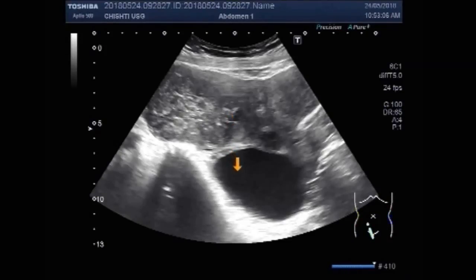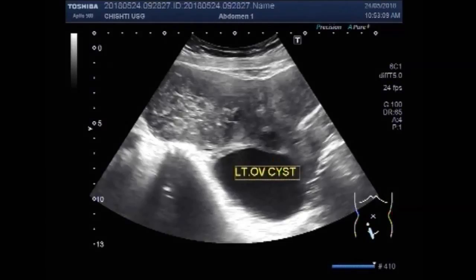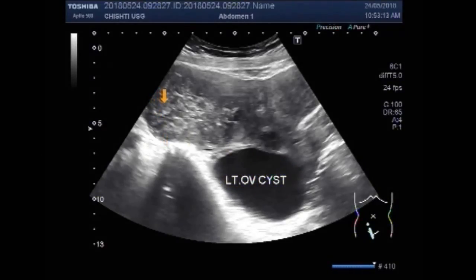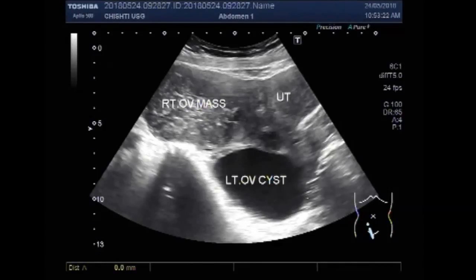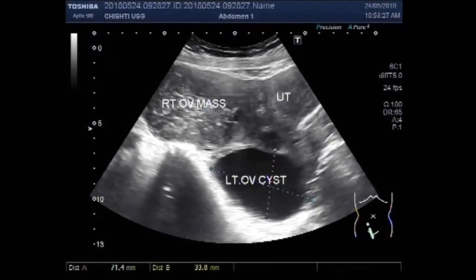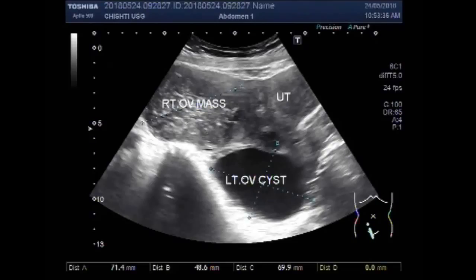Now you can see this is the left ovarian cyst and this is the right ovarian mass. The cyst is round to oval in shape and has clear fluid in its interior, while the right ovarian mass is semi-solid to solid in consistency.